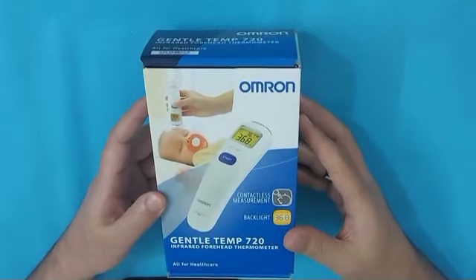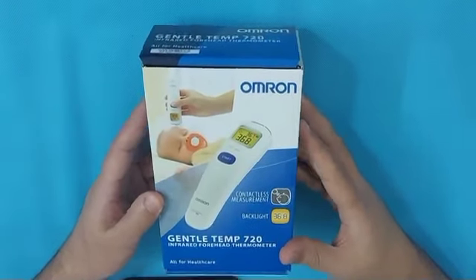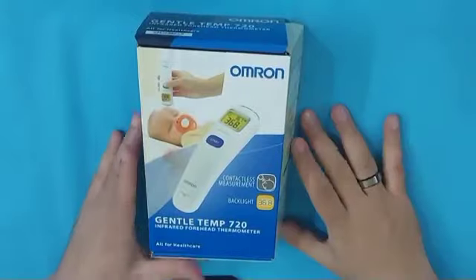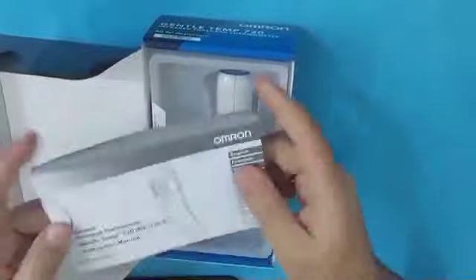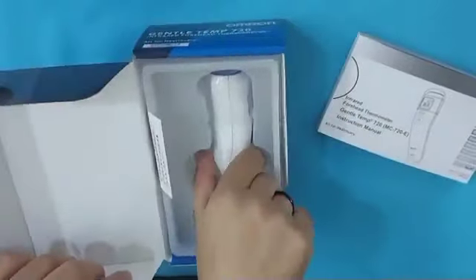Hello, this video demonstrates how to use an Omron thermometer. This is the Omron Gentle 720 infrared thermometer. I'll show you how to use this non-touch thermometer properly and explain the hidden features of this thermometer.